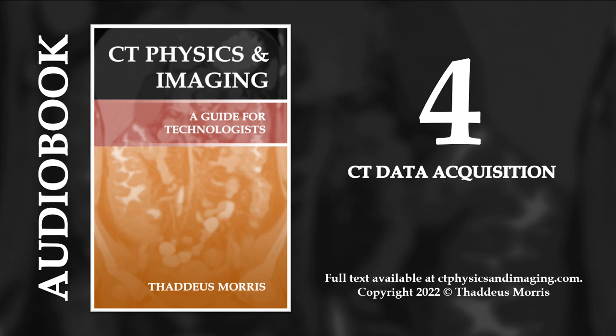Case study: helical malfunction. A CT of the chest with contrast is requested, but the helical mode of your scanner is not functioning. Could the axial mode be used for the scan? Here's the solution. Don't even try. When iodinated contrast is injected intravenously, it will fill the vasculature of the chest within 30 seconds, and be nearly gone within 60 seconds. Helical scanning allows the chest to be imaged rapidly during peak contrast enhancement. Axial scanning would not be finished in time to view the contrast while it's still concentrated in the chest.